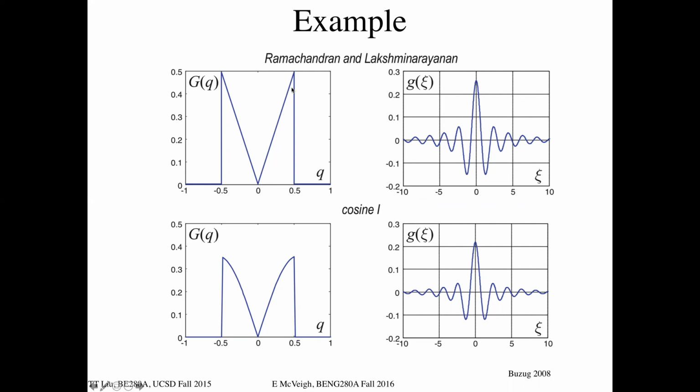And the reason for this weighting, just from a sort of common sense Gestalt reasoning, is that as we go out in higher and higher frequencies, as K gets larger, the density of samples I have out there gets lower and lower, right? And it actually gets lower as 1 over K, right? So if I'm on a radial line through Fourier space, and I look at my neighboring points as we're all traveling out together, it gets to be lower and lower density. And so this correction factor basically multiplies the weighting to compensate for that density, right?